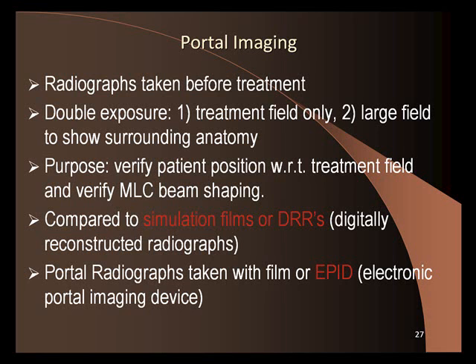If you look at any gantry, you'll see this little section right here, and this is an arm that swings out. And the patient would be on the couch here. And then there's an arm that swings out of here, and this is an amorphous silicon digital plate.